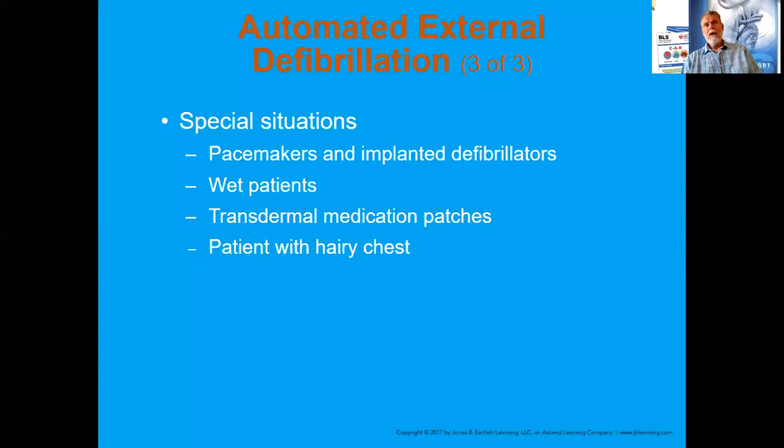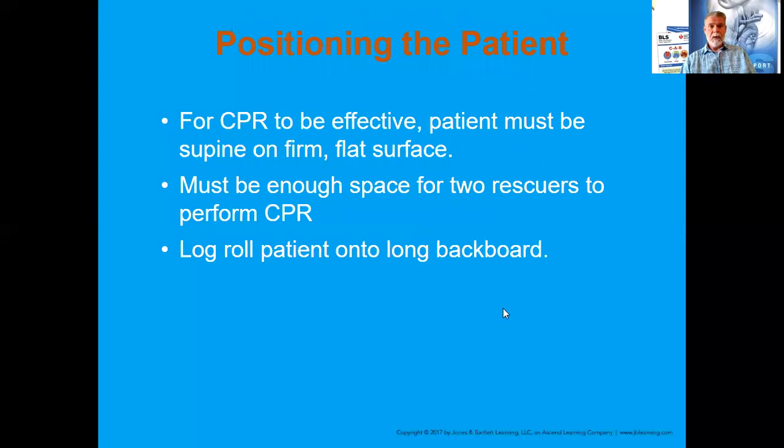Medication patches. This sounds like a test question if I was one, and I might say, how do I remove the patient's transdermal medication patch before I apply my AED pads? And of course, that's always with a gloved hand, right? Gloved hand, a towel, something. What does transdermal medication do? Well, see chapter, whatever it is, pharmacology. But there's certainly that potential when you touch that, that the effects of the medication can now affect you. So that's why we want to be careful and always use our protective equipment.